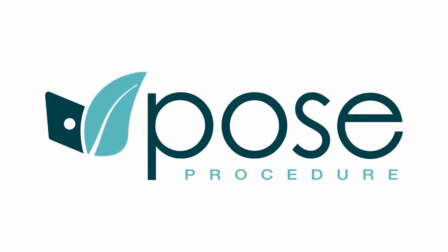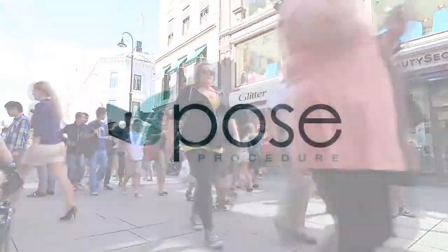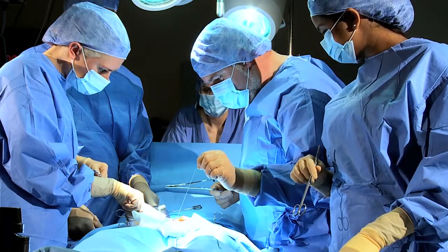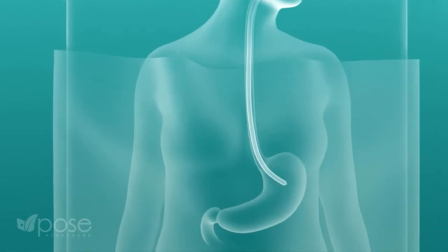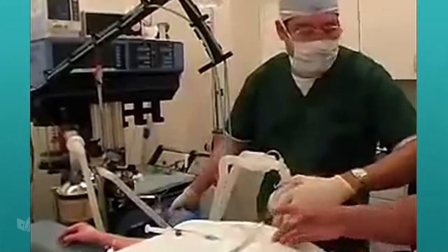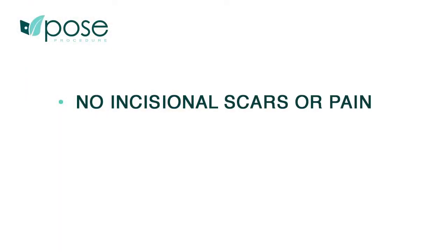The POSE procedure is a credible option for patients with obesity who wish to return to and maintain a healthy weight without the risks associated with more invasive surgical procedures. The incisionless operating platform is inserted endoscopically through the mouth and esophagus into the stomach, used to shrink the stomach size from the inside. The procedure is performed in less than one hour under general anesthesia, with no cuts in the abdomen.